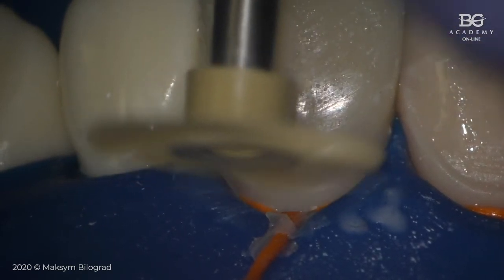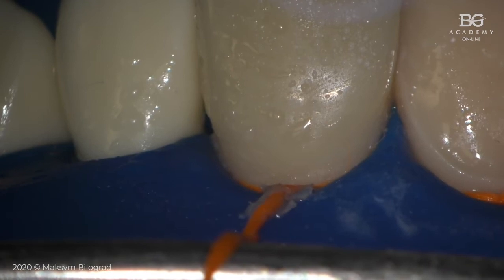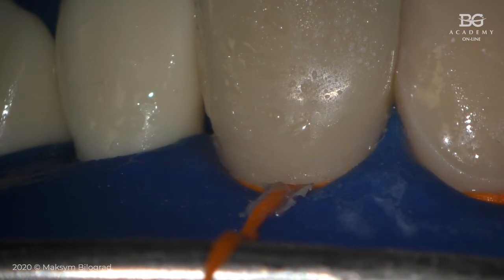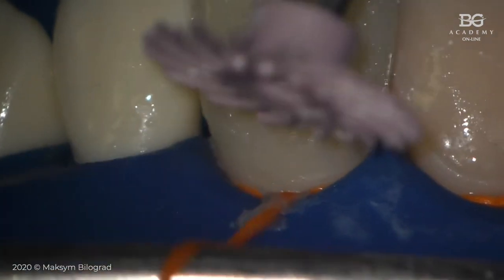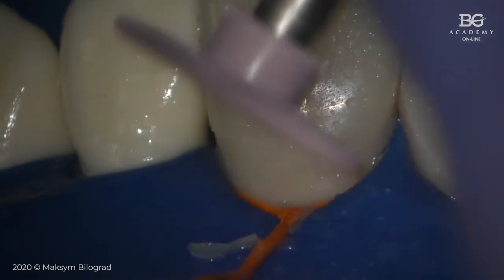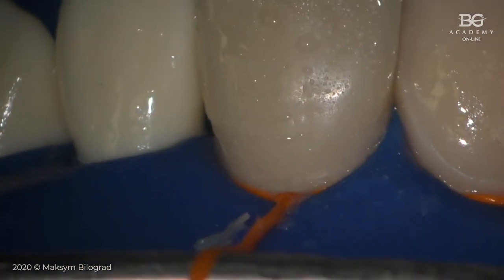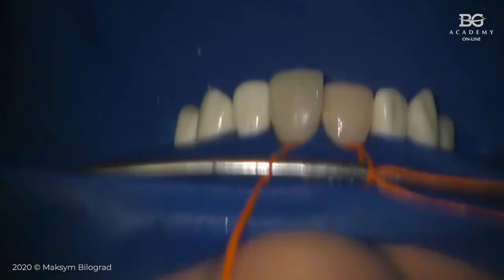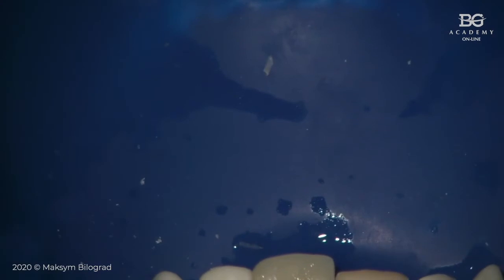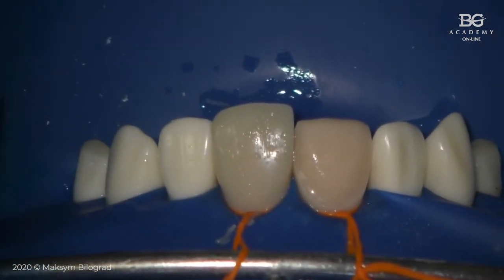5,000 RPM with a little bit of water. And then I'm taking another thing, which is a spiral also, but purple. And purple is the polishing one. With the same speed, with a little bit of water, you go this way. Okay. So basically it's done. The polishing is good, integration is good, everything is good.